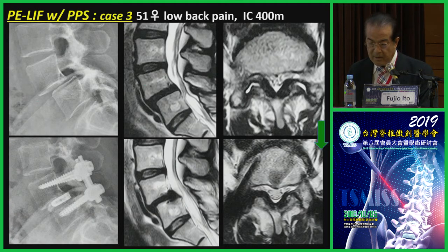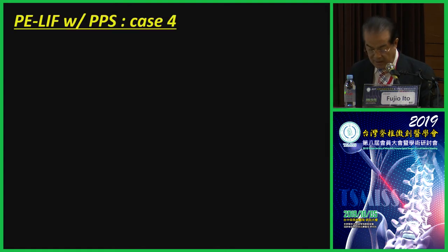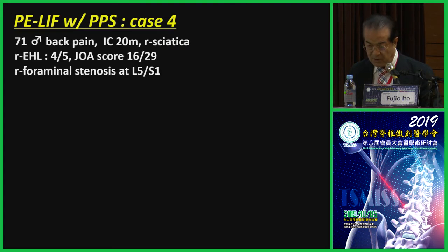PE-LIF case 3. There was a 51-year-old woman who suffered from severe low back pain and 400-meter intermittent claudication. 1 year after PE-LIF, symptoms disappeared and MRI showed improvement of stenosis. This patient was a 71-year-old male. He had moderate back pain, 20-meter intermittent claudication, and severe right sciatica.